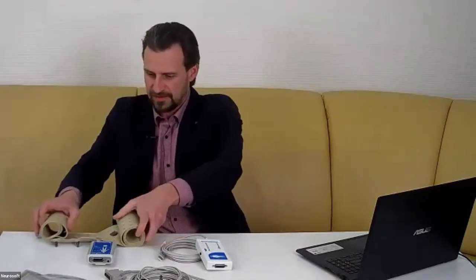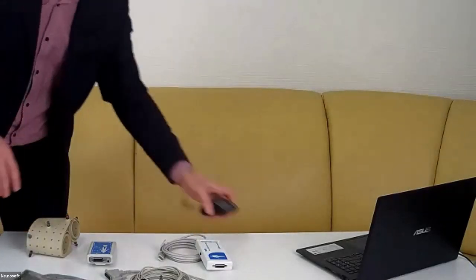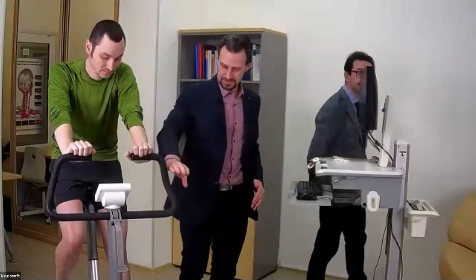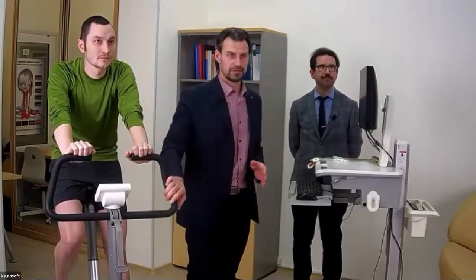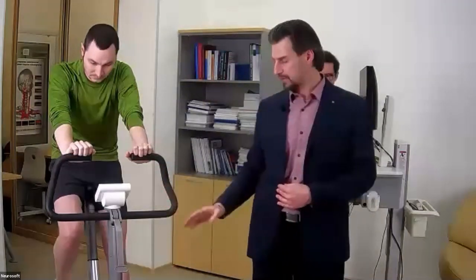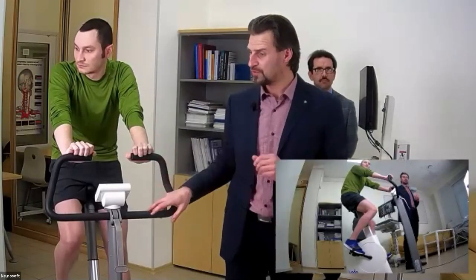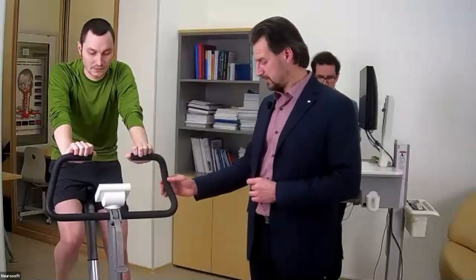Now let me show you our exercise devices. In our showroom we have two exercise devices. You can see this bike from the Lode company. In the corner of our showroom we also have a treadmill from the Medan company, Poland. But today we will use this bike for our stress test presentation.